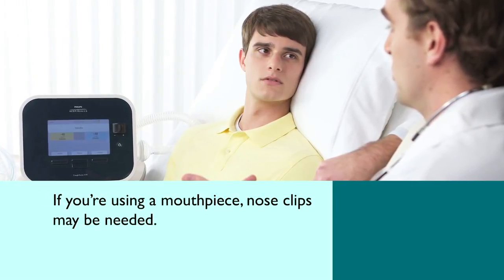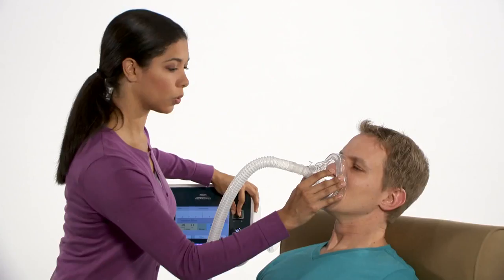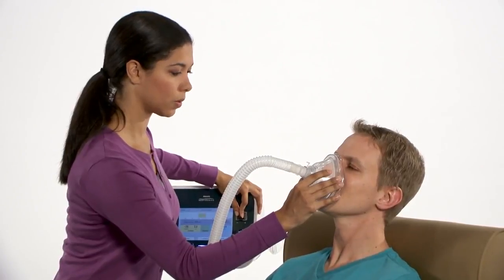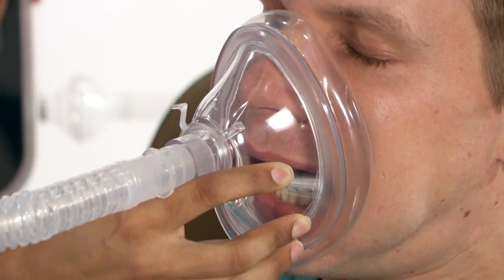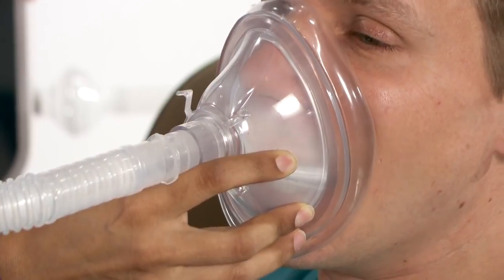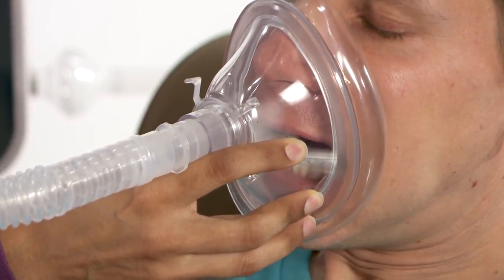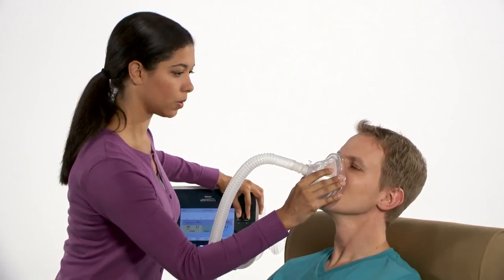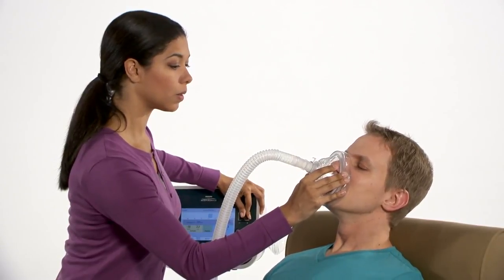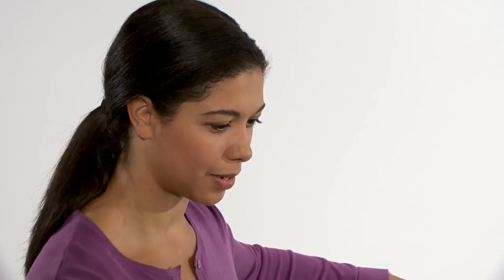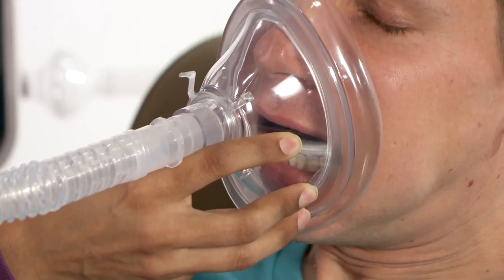If you are using a mouthpiece, nose clips may be needed. Instruct the patient to open his mouth and actively inhale during inhalation and exhale during exhalation, which will open the airway for unobstructed airflow. Ask him to keep his mouth open and tongue down throughout the therapy. Encourage the patient to be relaxed and passive during the inhalation and the exhalation cycles.